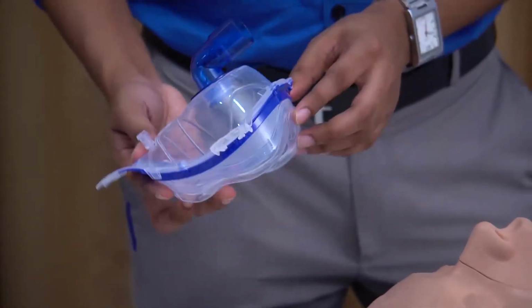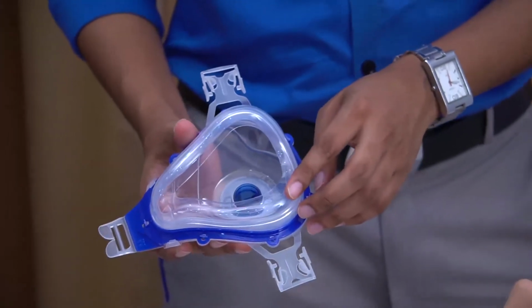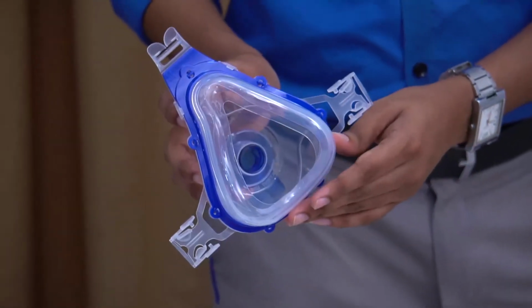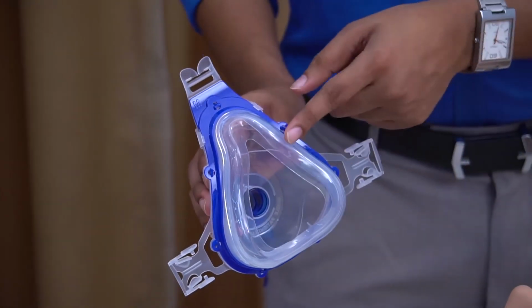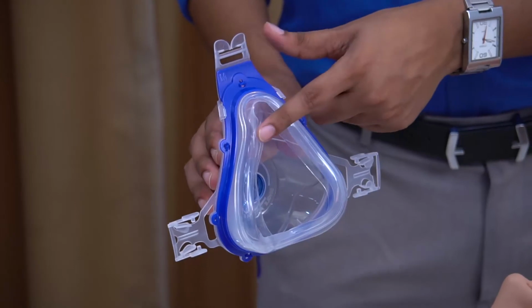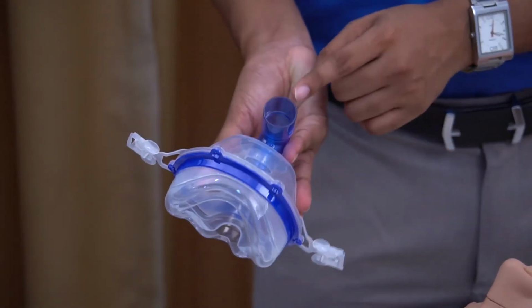CPAP mask, patient interface. This looks like a normal face mask, but this has special features too. This surface helps to achieve a good seal to the face of the patient. This piece connects the tube from the CPAP machine.